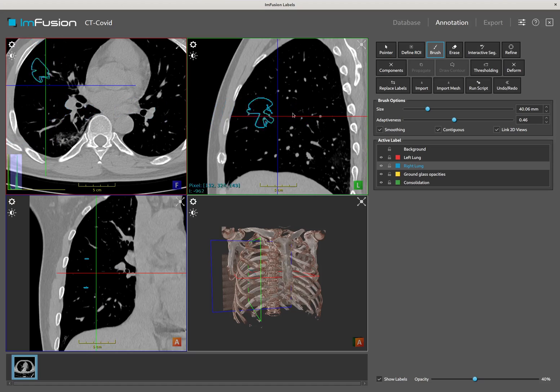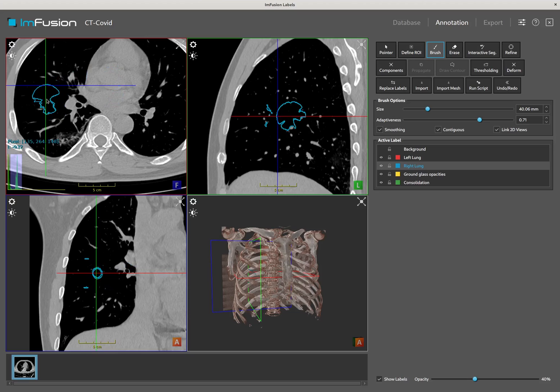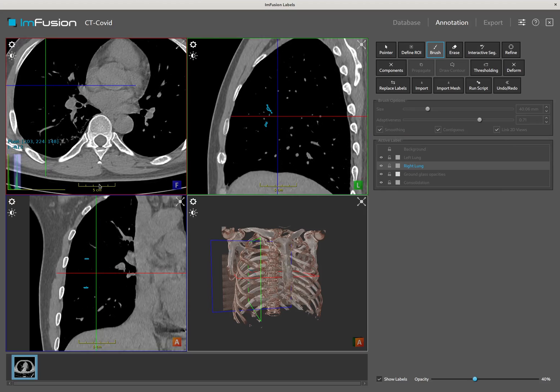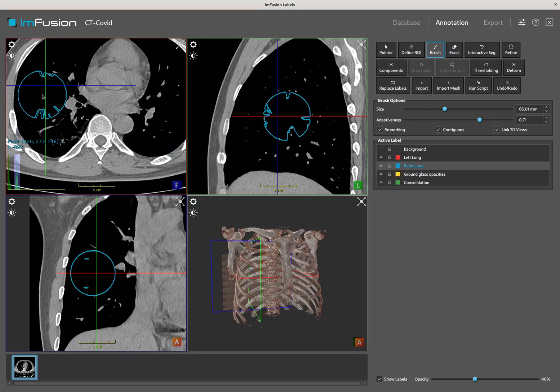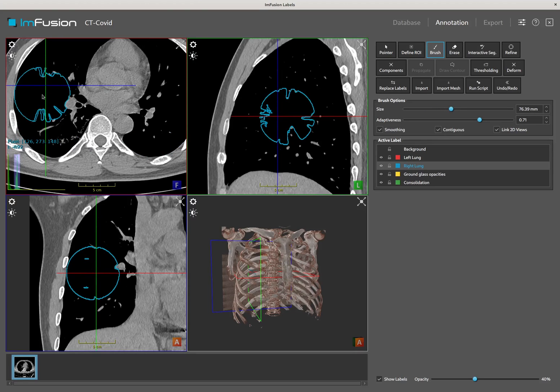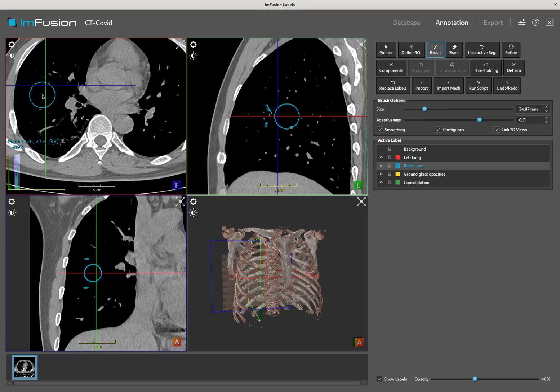The sensitivity of this feature can be controlled with the Adaptiveness slider. The higher the Adaptiveness, the more sensitive the brush will be to intensity differences. In addition, the brush takes into account the windowing applied to the image. For this reason, it is advisable to tune the windowing to maximize the contrast around the features to be segmented. In this case, I will start with the air and try to avoid the vessels. Since the contrast is high, I can comfortably use a high radius and a high adaptiveness. The Ctrl plus mouse wheel shortcut can be used to change the radius, and Alt plus mouse wheel can be used to change the adaptiveness.